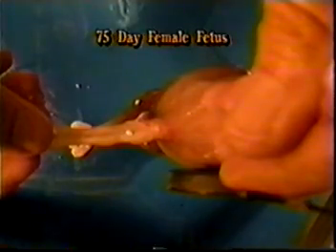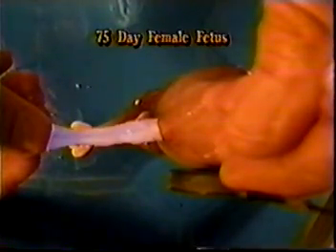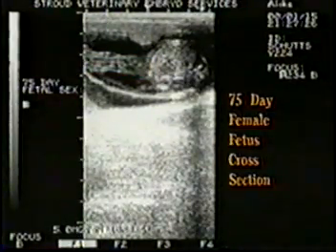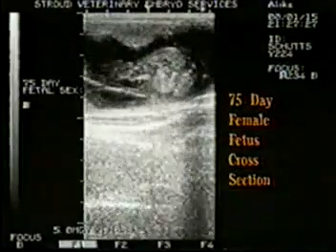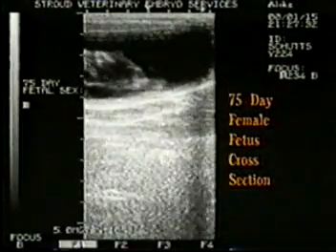This actual 75-day female fetus is fixed in the same position as the previous ultrasound view. The umbilical cord is highlighted for reference purposes. As the transducer moves distally from the umbilicus towards the tail, note the lack of a male GT.